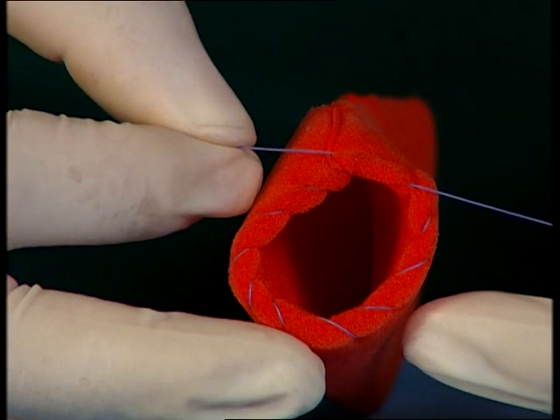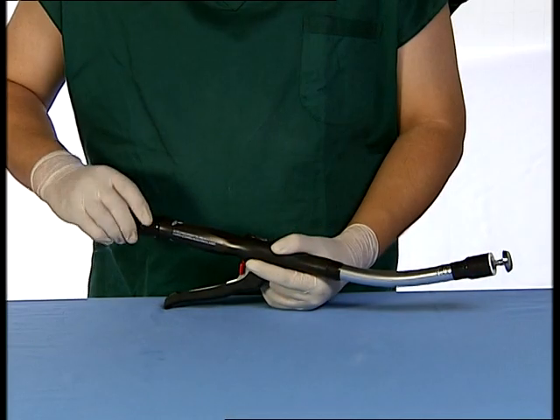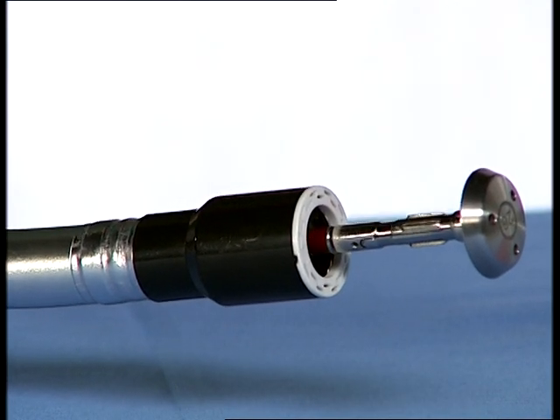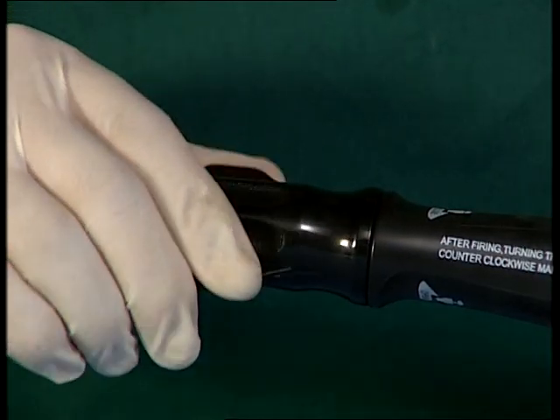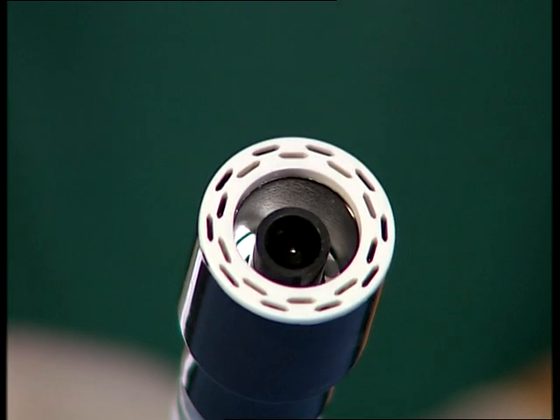Purse string sutures are first placed in the location of the anastomosis. Open the instrument using the wingnut until the red tying area on the trocar is visible. Remove the detachable anvil assembly to expose the trocar. Retract the trocar to slightly below the staple cartridge face by rotating the wingnut clockwise.